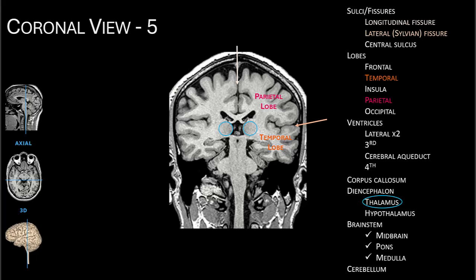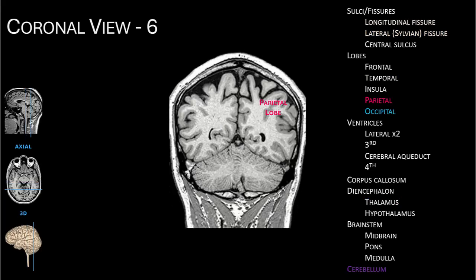We also see the posterior region of the thalamus and the already noted brain stem, including the midbrain, pons, and medulla. This is our last coronal view. The posterior location lets us see the parietal lobe, occipital lobe, and cerebellum.